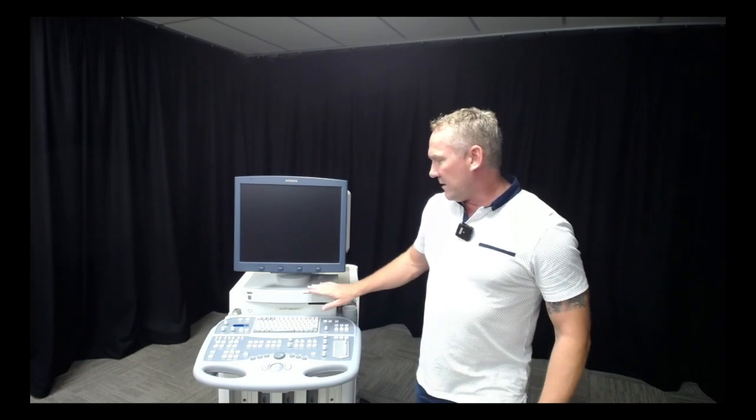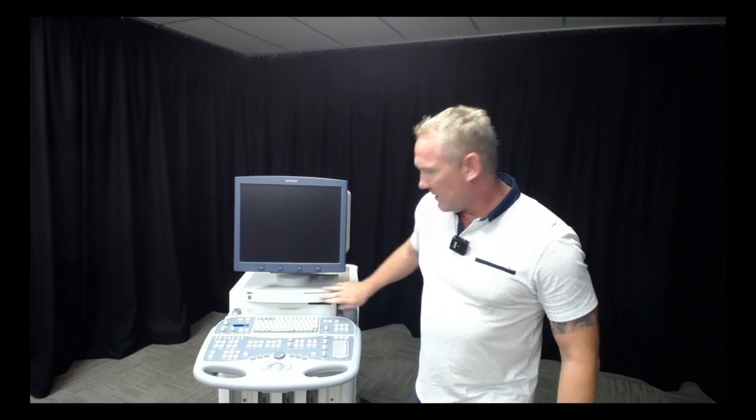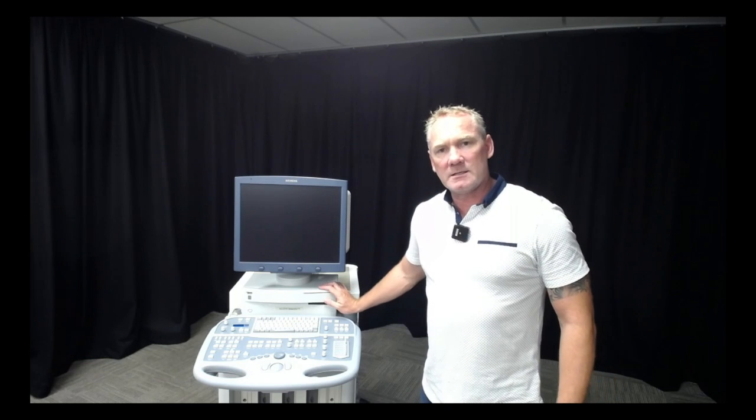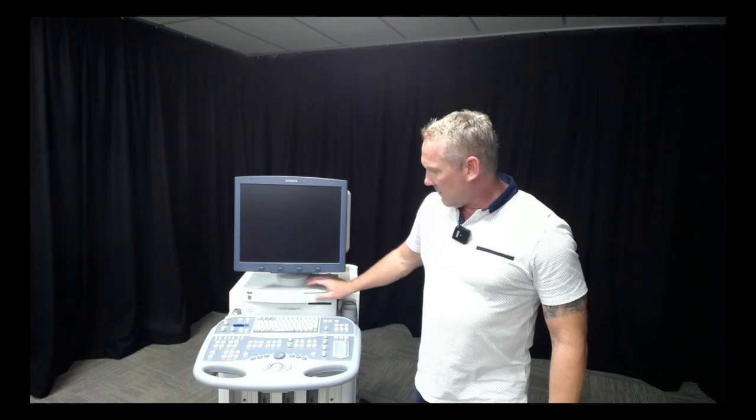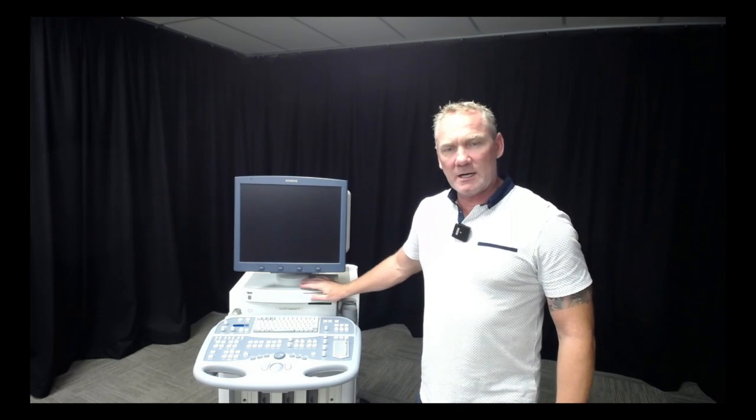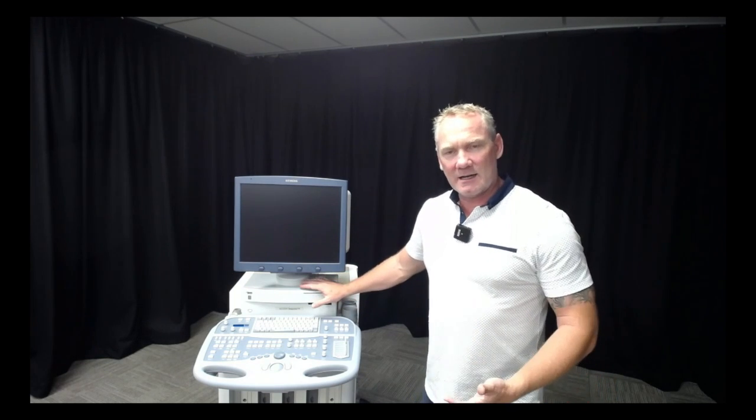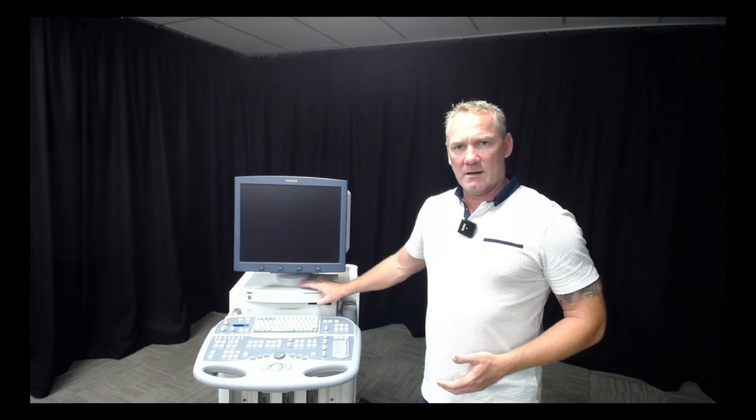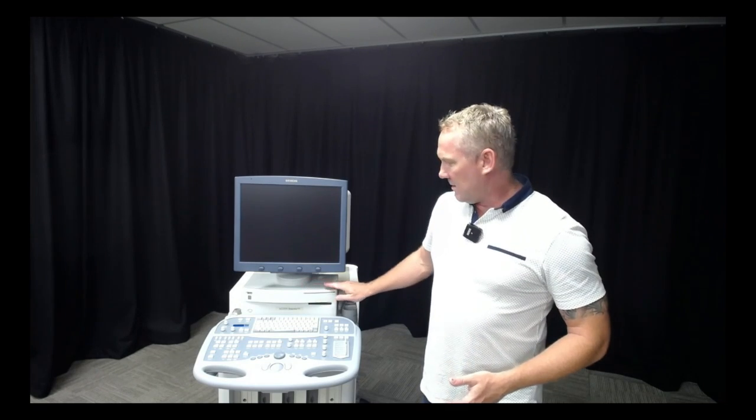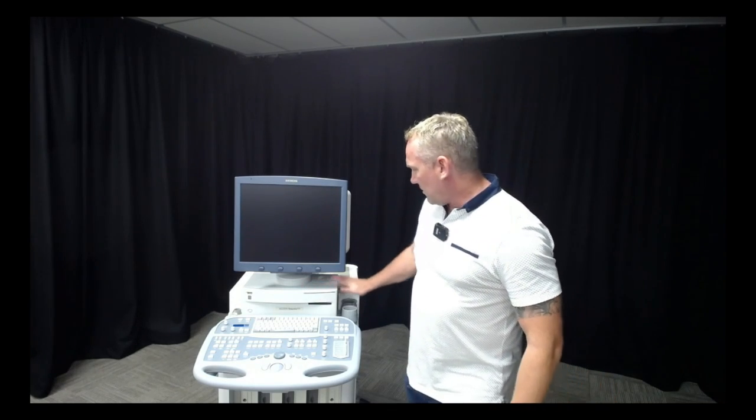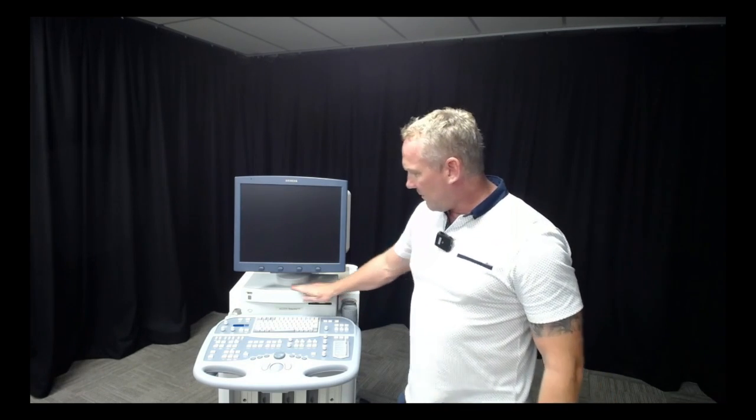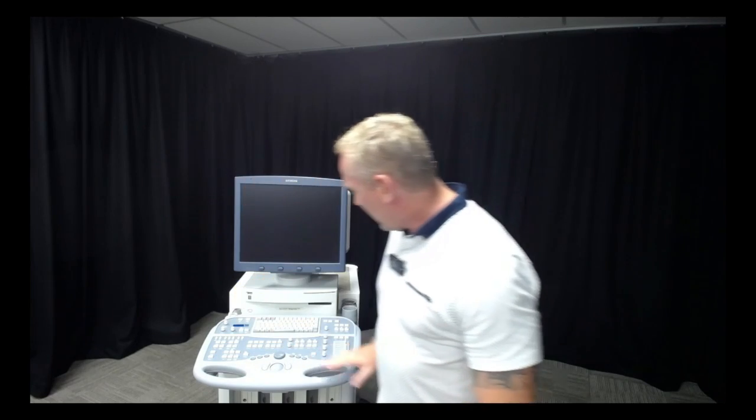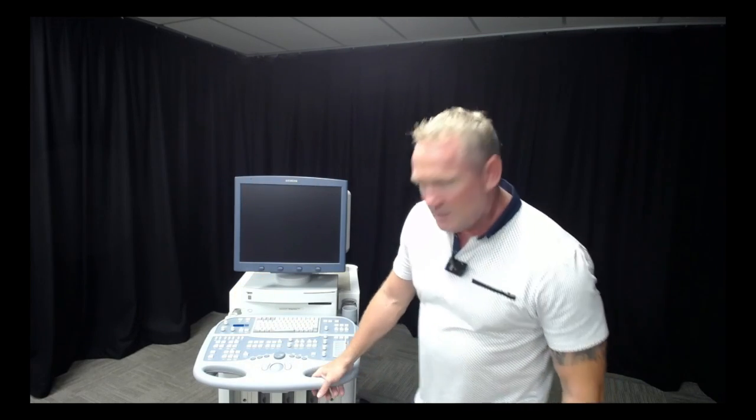You end up with adhesive residue on the machine that doesn't get cleaned off properly, which makes it a yucky spot. I've taken all that off and polished the machine up. I paid particular attention underneath where the console goes up and down.